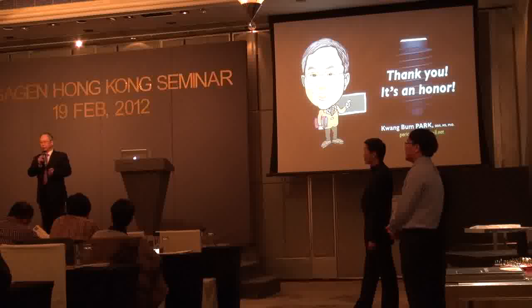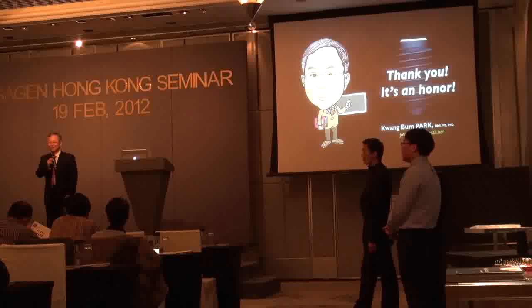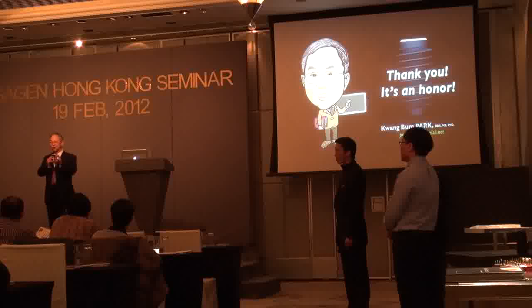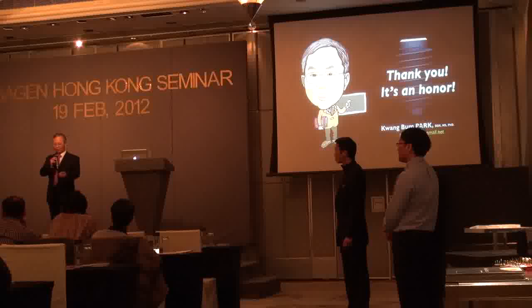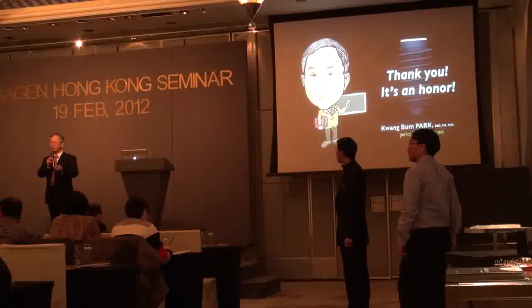Yes, the first question, the answer is, it's up to you. It's a very ridiculous answer, right? But we changed the drill sequence, totally different from other conventional implant systems. As a doctor, we have to decide what kind of bone the patient has, and according to that we can modify. 5 millimeter is not mandatory.